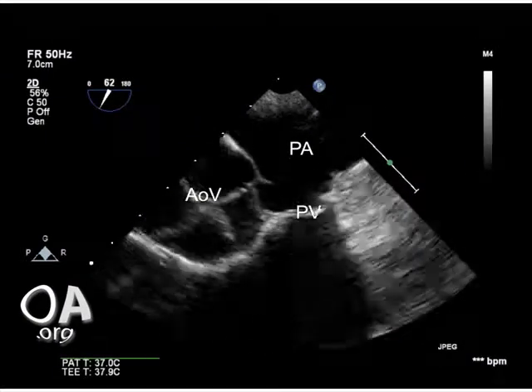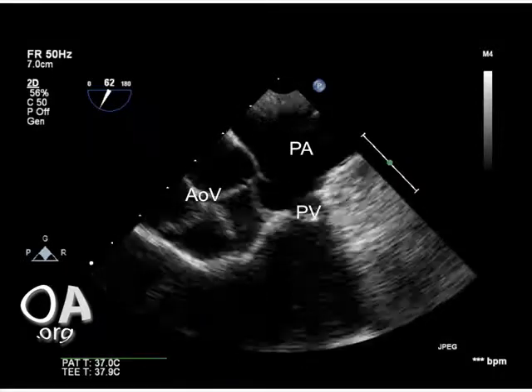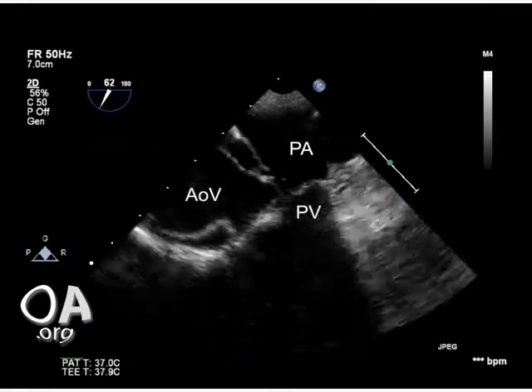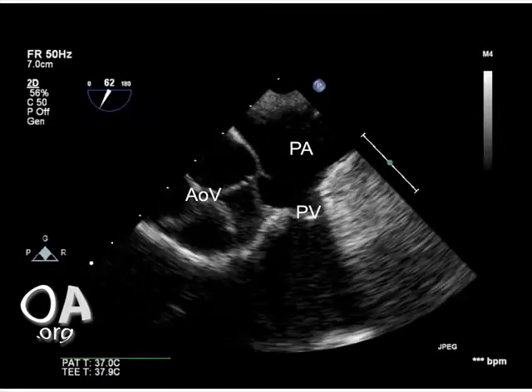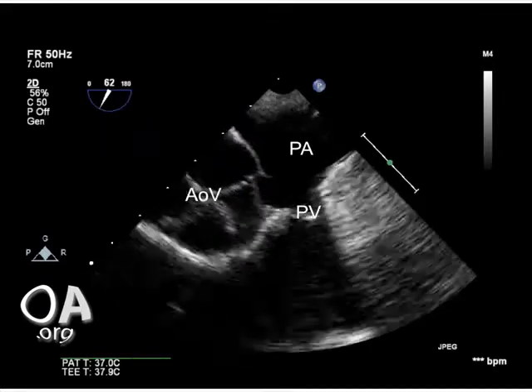This is the view of the aortic valve as labeled on the left side of the image and the pulmonary valve and pulmonary artery on the right side of the TEE. The right ventricular outflow tract appears to be stenotic here at the level of the pulmonary valve. Remember, our patient had a transannular patch placed to widen her pulmonary artery as a child, but this is difficult to visualize via TEE.